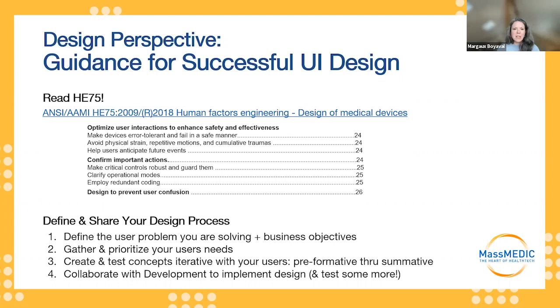You can see it's really relevant to today's conversation about optimizing user interactions, confirming important actions, designing to prevent user confusion. So there's a lot of good material in there, even if you just look at what's in the contents, it can really start to spark ideas and think about it. But this is a great guidance document if you have never designed medical devices before and really want to know more. A lot of great minds gave input to this.